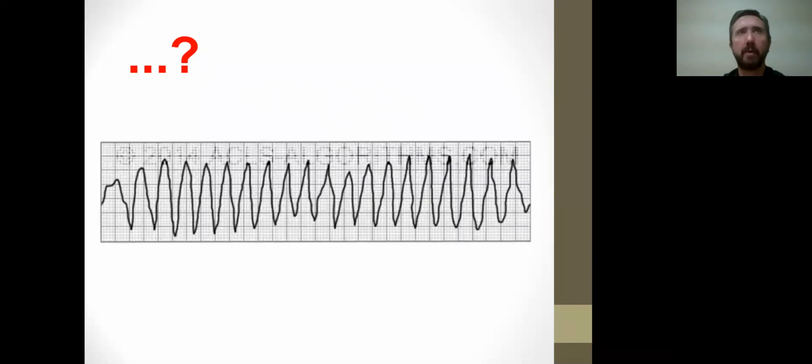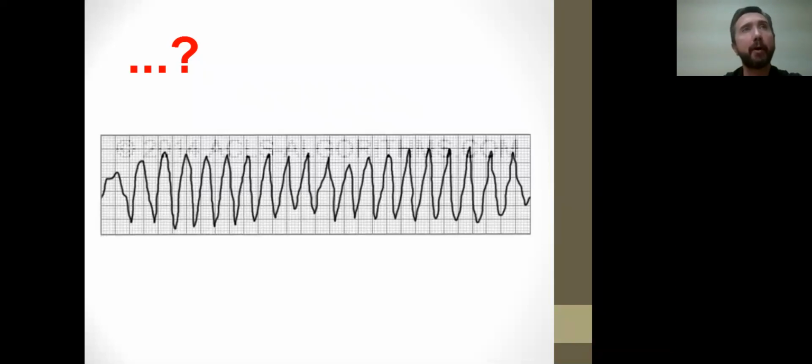So what are we going to do here? I'm going to give you a little bit of a scenario. We respond to a 56-year-old female complaining of shortness of breath. She has palpitations. After assessment and appropriate interventions, our vital signs indicate a blood pressure of 70/30, a heart rate of 220, and a respiratory rate of 40. You place the patient on the cardiac monitor, and this is the presenting rhythm. That gives us the uh-oh factor, right? It's creating this sense of urgency, at least it does in me, and I'm sure it does for you as well.